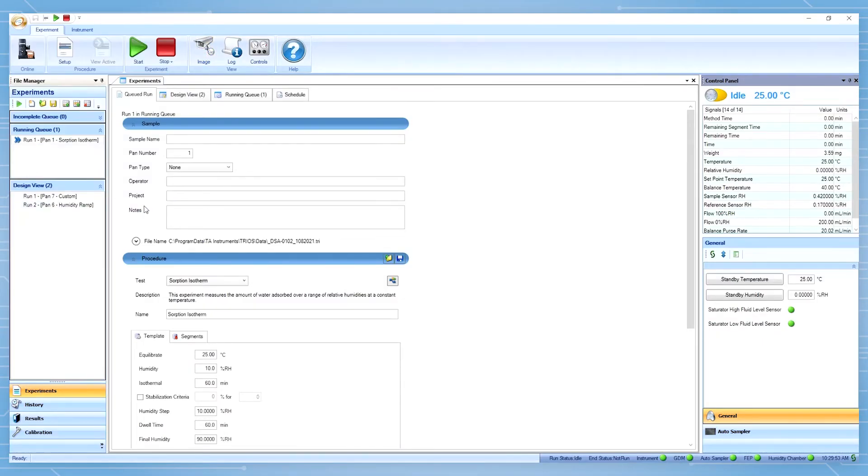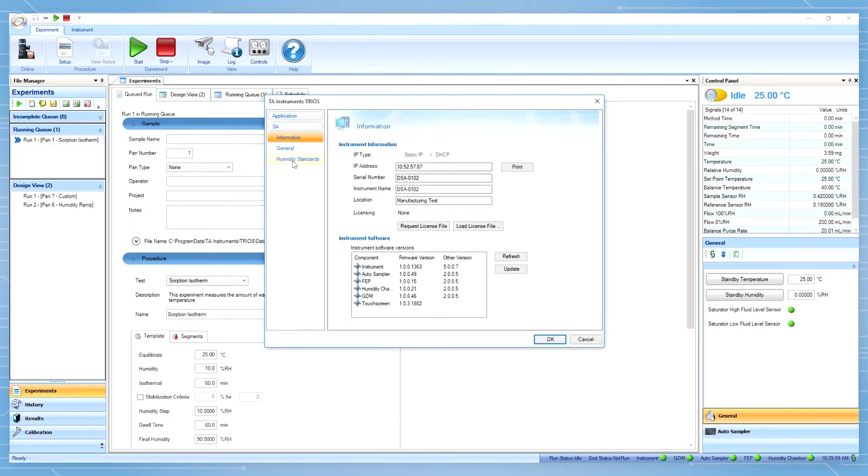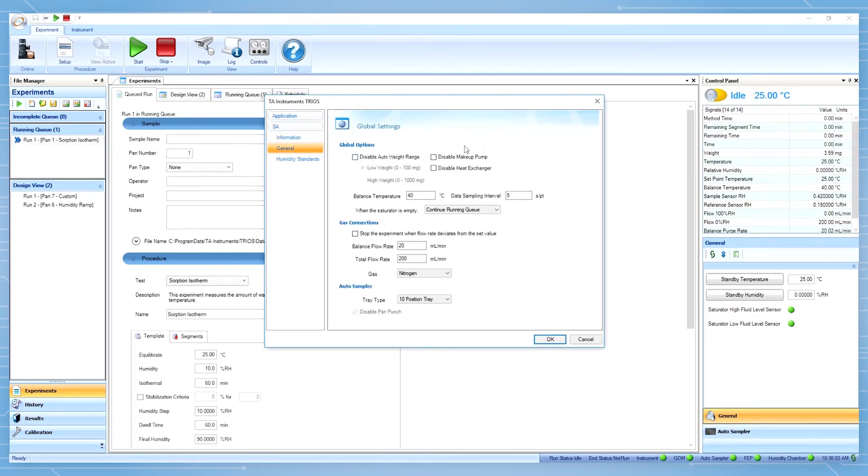In TRIO software, go to TRIO option, general, global option selection, and make sure that the disable makeup pump box is unchecked. You can also select what will happen when the saturator is empty.